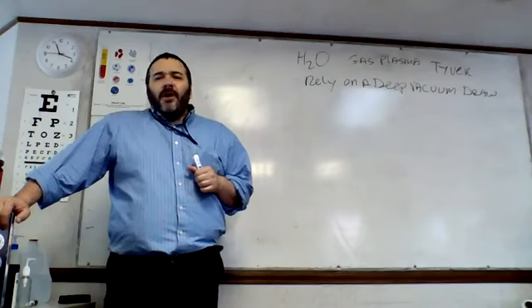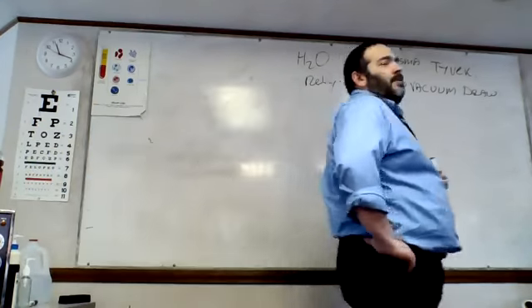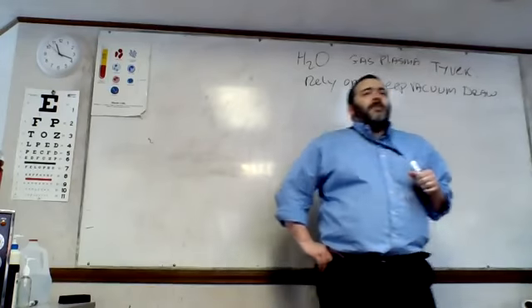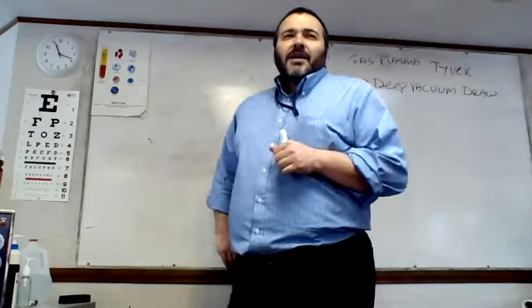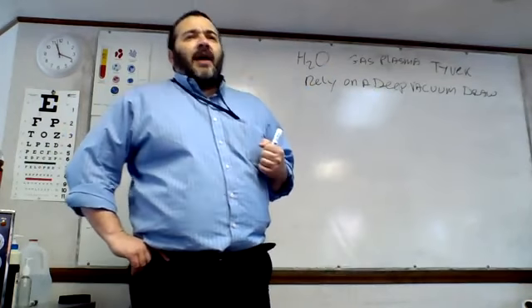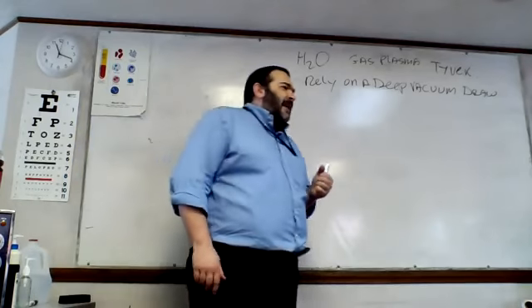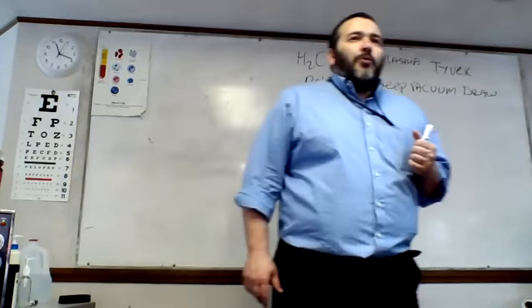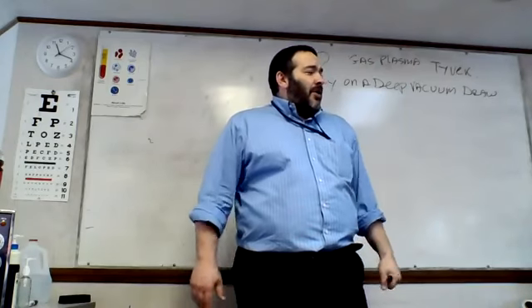Now, remember, well, I don't know if you remember, so I'm going to remind you. When we talked about dynamic air removal sterilizers, I talked about sucking out all the air from the chamber and creating as much of a vacuum in there as possible. And I told you why we did that. Because low pressure or vacuum reduces the boiling temperature of water.